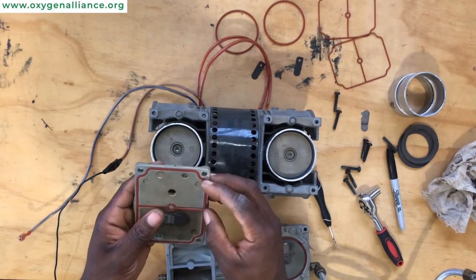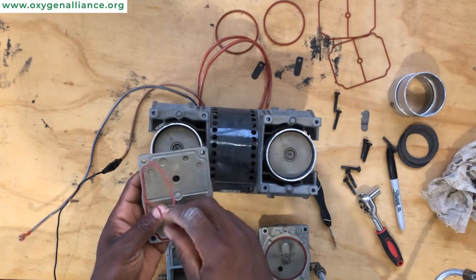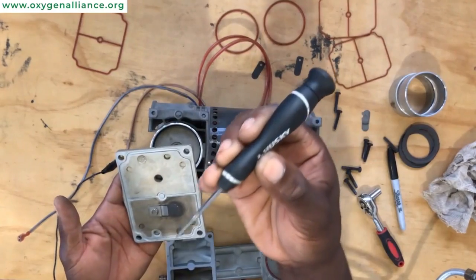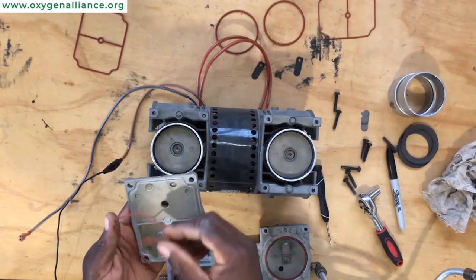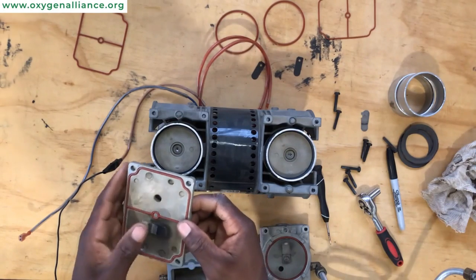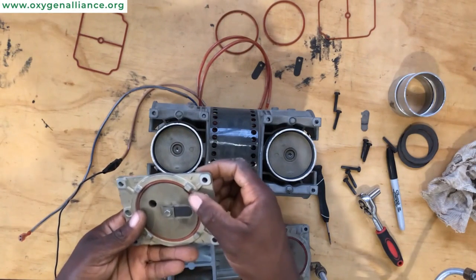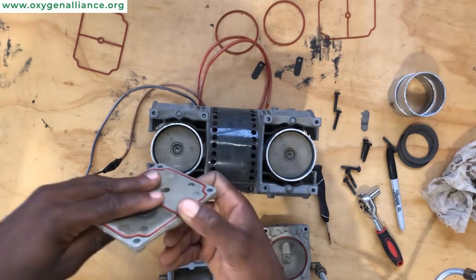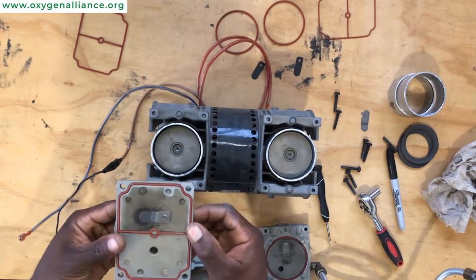We'll now jump on to changing the head gasket. If it's easy to remove, you can just peel it off, but if you're having trouble peeling it off, you can use a flat screwdriver to remove the head gasket. Get the new head gasket and put it where the old head gasket was. For the o-ring, we examined it and we didn't find any damage, so we just maintained the same o-ring that was there originally.